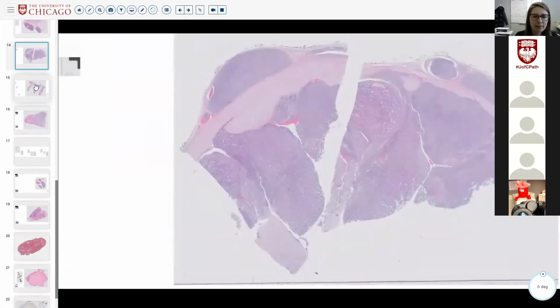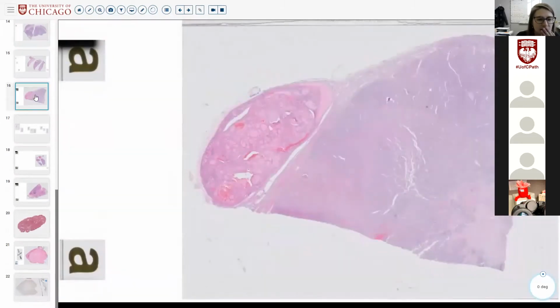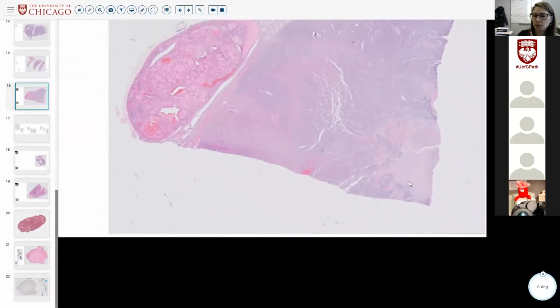All right, so I'm giving you more examples of more neoplasms. Maybe we can do this one next time, because I do want to show you, I think you can all guess what these answers are, but I do want to show you true tumor necrosis.